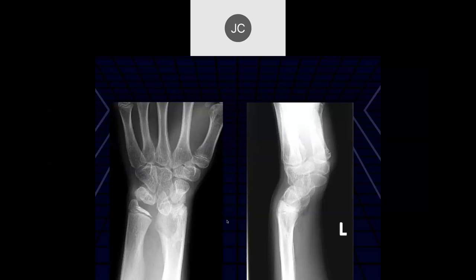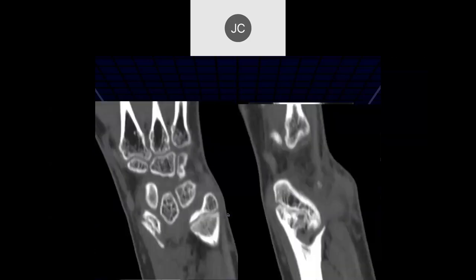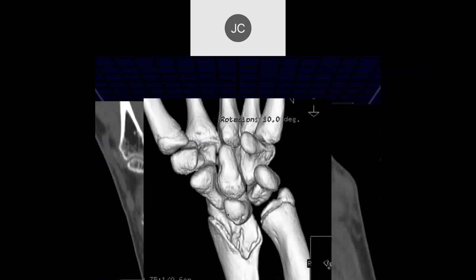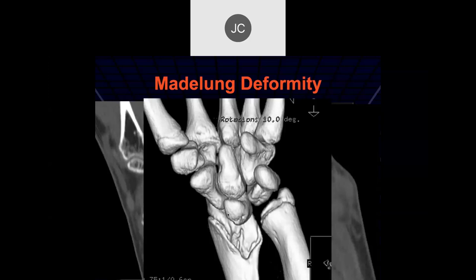We see a deformity of the distal radius, a pointed lunate, probably a little negative ulnar variance with a flexor deformity. On CT scan and 3D reconstruction this is more clearly seen. This is just a more prominent Madelung deformity.